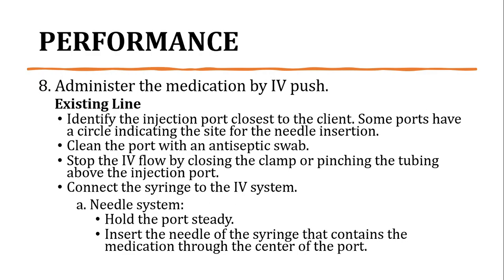Then clean the port with an antiseptic swab to maintain the sterility of the procedure and to prevent introduction of microorganisms into the vascular system of the client. Stop the flow by closing the clamp or pinching the tubing above the injection port. Ginagawa po siya itong clamping of the IV flow para yung medication muna yung ma-administer sa client without the dilution po muna ng IV fluid.